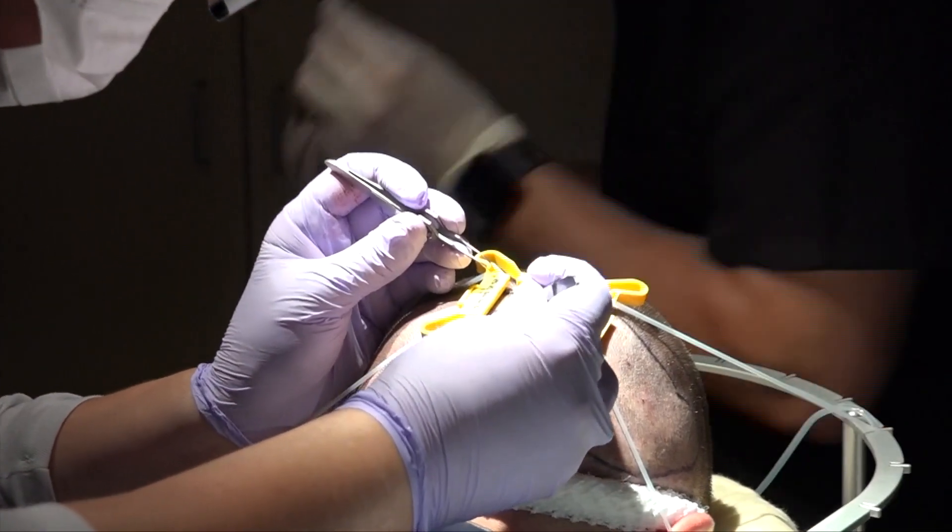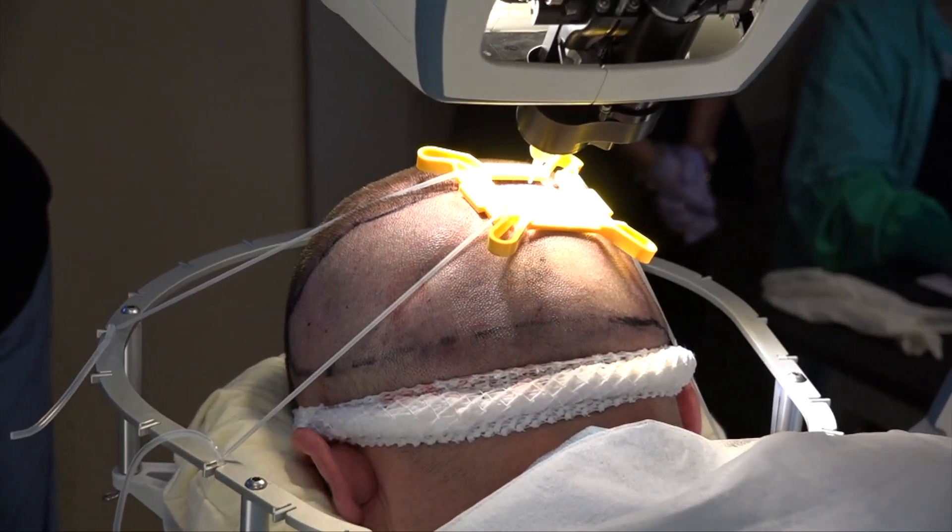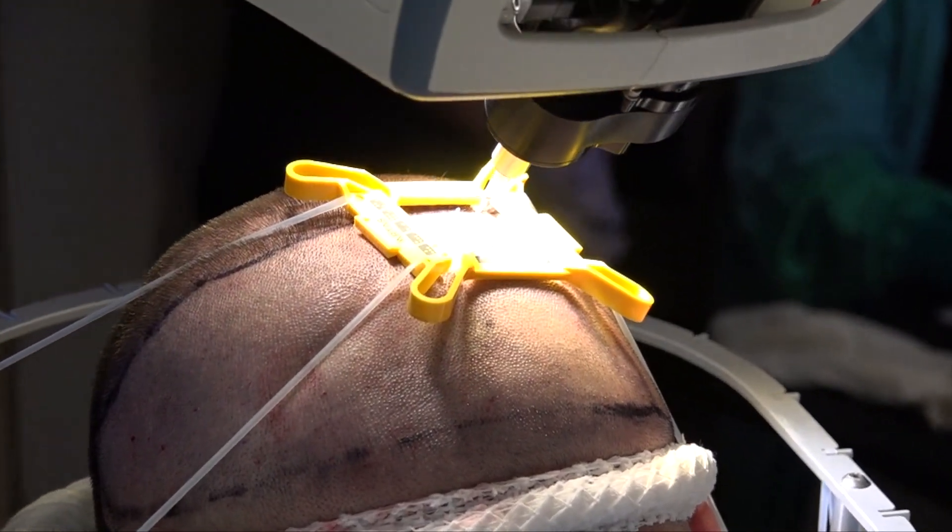Accuracy and reproducibility of the robot is unmatched. As you can see, Nick is doing great, very comfortable. We're talking with him as we go through the procedure.